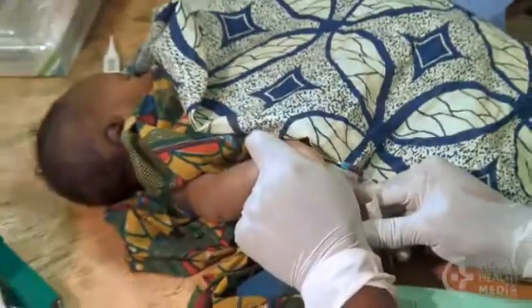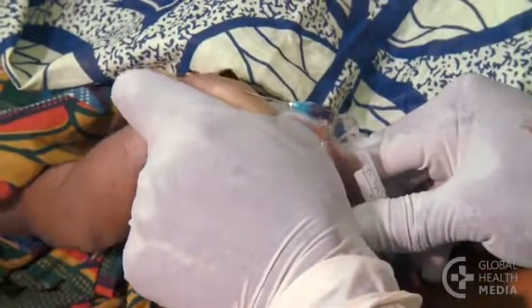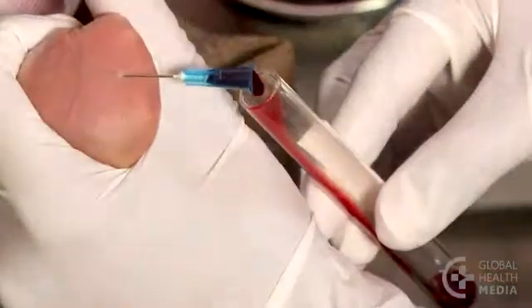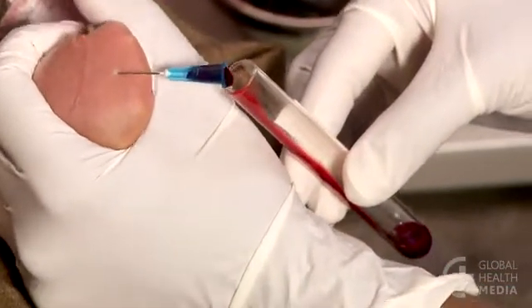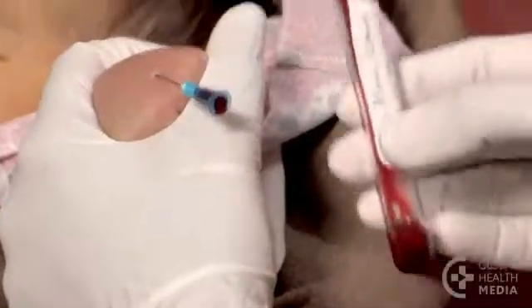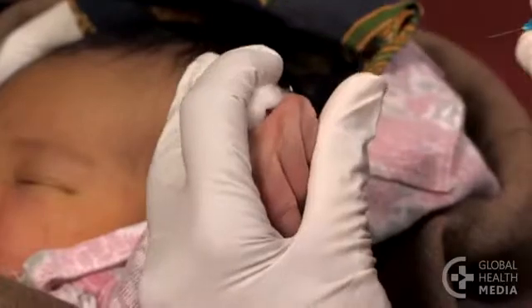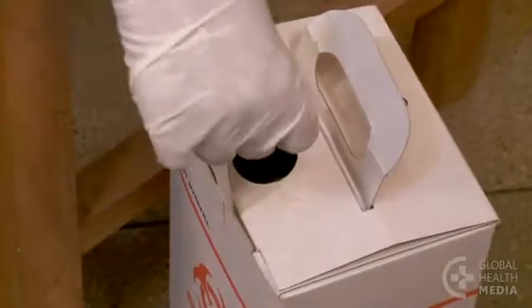Here's another example of how to squeeze the baby's hand. This method cannot be used for blood cultures, as it uses an open tube and so is not sterile. When you have the amount you need, remove the needle and cover the site with a cotton ball. Then safely dispose of the needle.